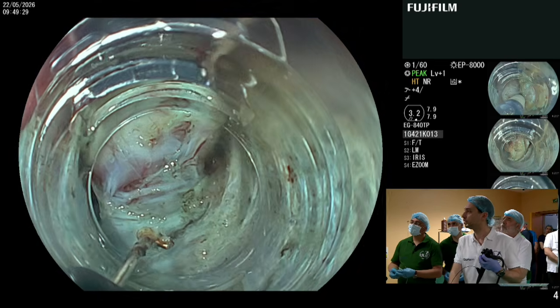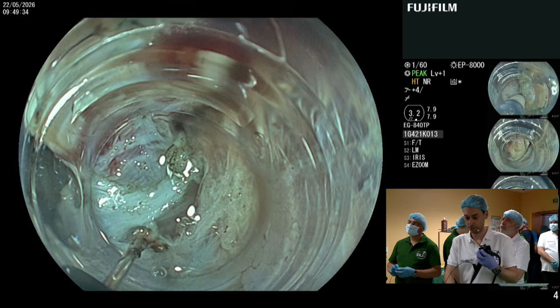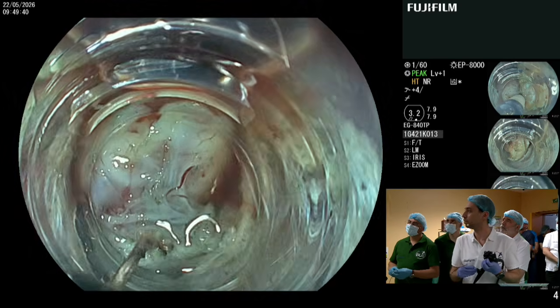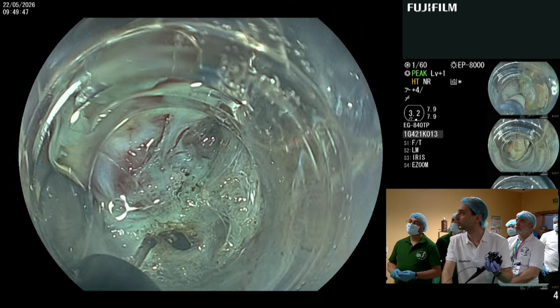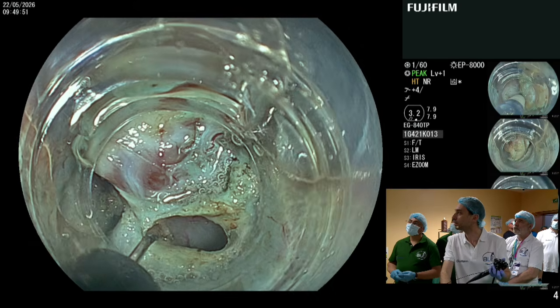All right. Okay, we induce a perforation, but that's the plan.